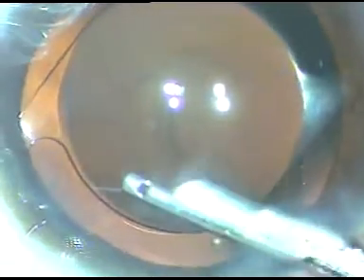Now I have to remove the viscoelastic substance. There is no vitreous in the anterior chamber, so I don't need to do vitrectomy in this case. I am removing the viscoelastic substance thoroughly. I don't go behind the intraocular lens at this stage — I just remove the viscoelastic substance in the anterior chamber and from the angle of the anterior chamber, all around. However, I feel that some viscoelastic substance remains in the Berger's space, behind the IOL.